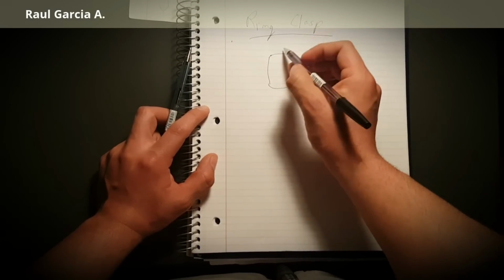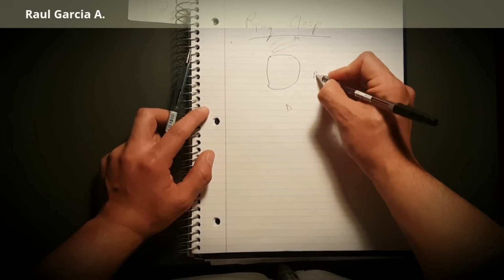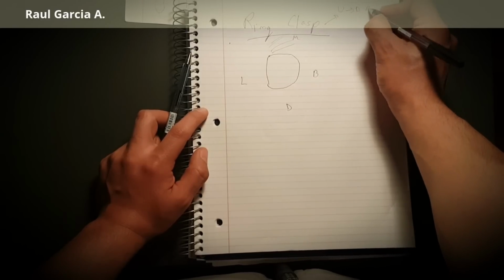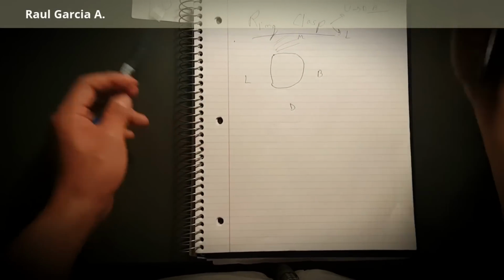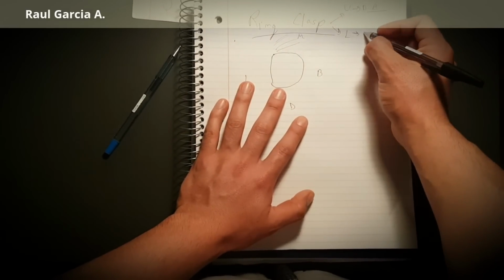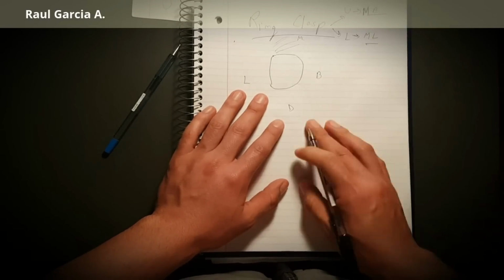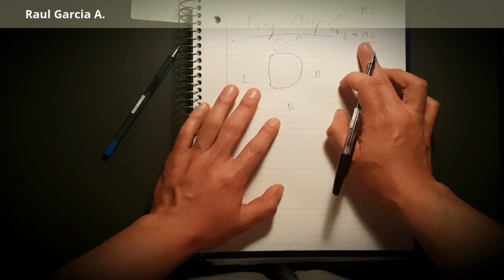Imagine this is a molar and this is a saddle area, okay? So we have no teeth here. This is the mesial, this is the distal, this is the buccal, and this is the lingual. So usually a ring clasp in the upper engages a mesial buccal undercut, and in the lower, usually, because it can be drawn vice versa but it will complicate stuff, it goes in a mesial lingual undercut. So in the upper a mesial buccal undercut, and in the lower arch a mesial lingual undercut.